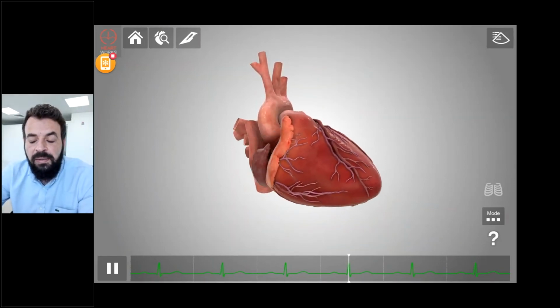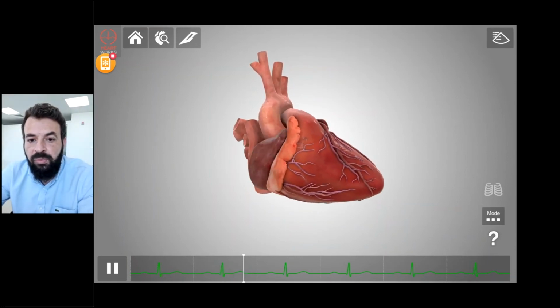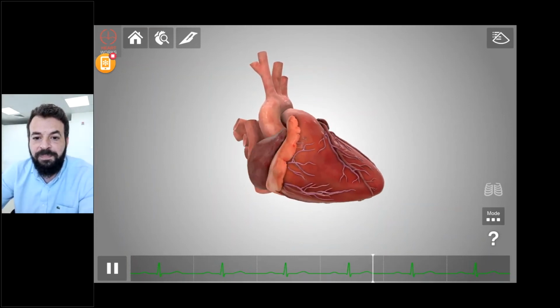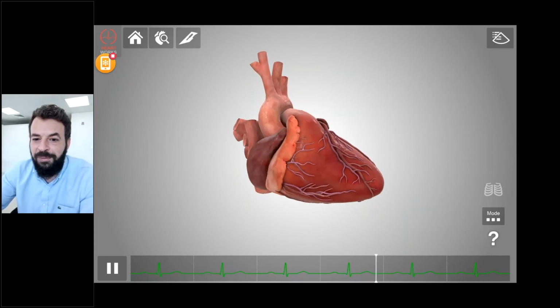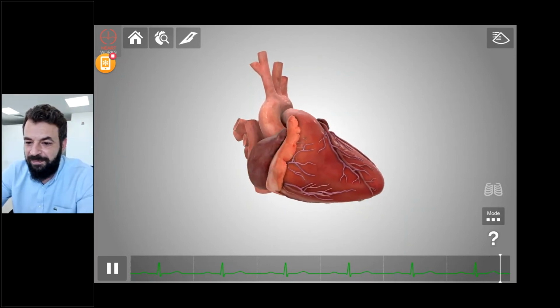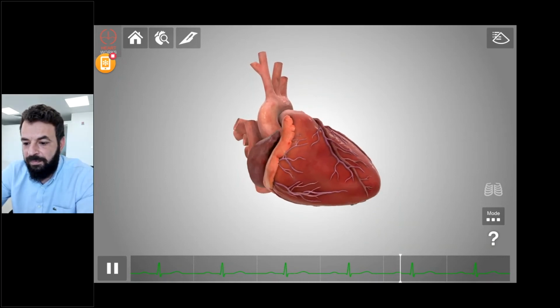Now, if anyone has any question, please do not hesitate to ask. Sharbel, this is Stephen with you from Bahrain, Gulf Pharmacy. Hello, Stephen. How are you? Hi, I'm fine. Sharbel, the ECG line that you have, do you have different types of arrhythmias that you can simulate?